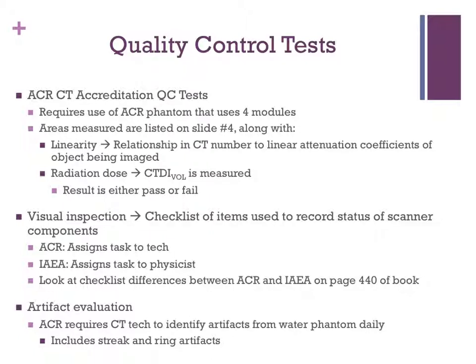So there are 18 quality control tests that are popularly performed, and the book outlines them all in depth and in detail. And I also included these in my PowerPoint slide as well for chapter 18. I'm not going to go over each of them just because it would add to the length of this video and be very lengthy. But I do want you to look over them in the book and also maybe on the PowerPoint slides, as I outlined the specific details and the important factors regarding them.